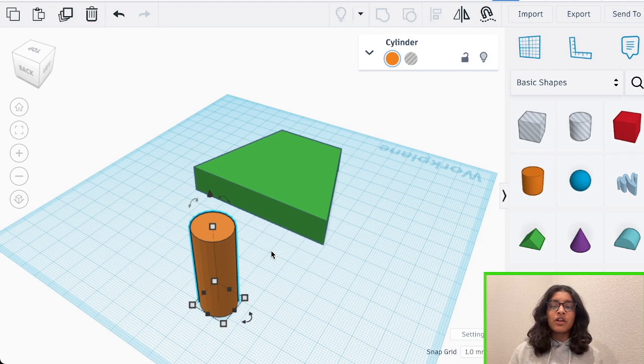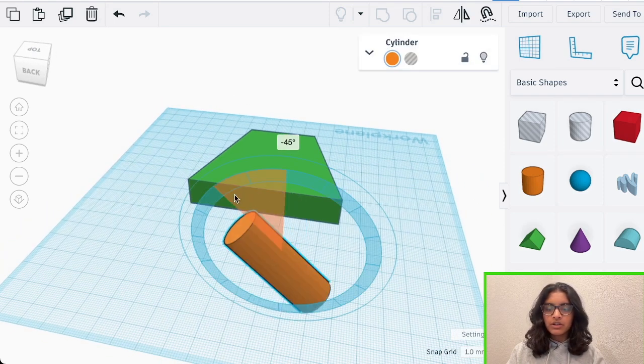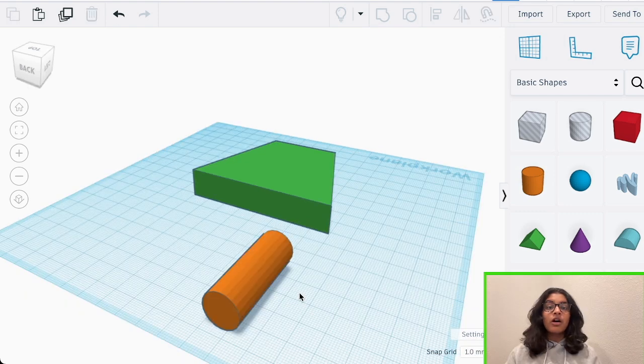Alright, so after you've got the desirable dimensions for your cylinder, just turn it over 90 degrees and the same thing, bring it to the floor of the project and make it in the same orientation a finger would be in comparison to your palm. Alright, so the next thing we're going to work on is making the very specific curvature that a finger has. If you look at your own finger, you can see almost half of a parabola for your curved finger.